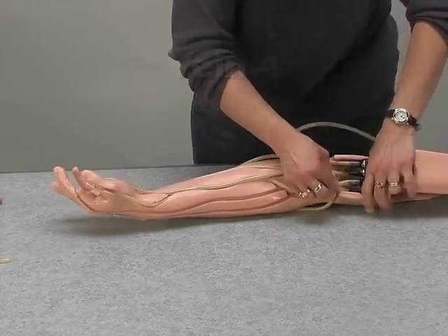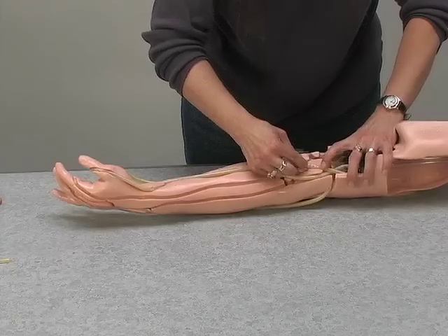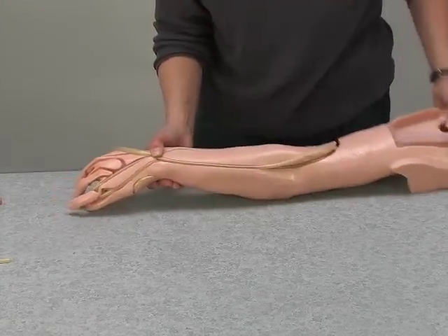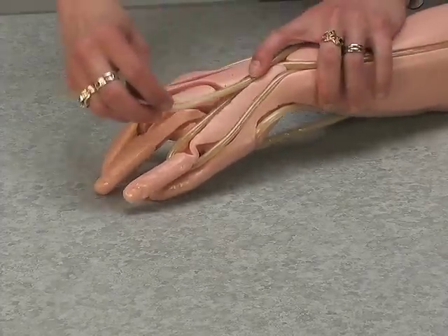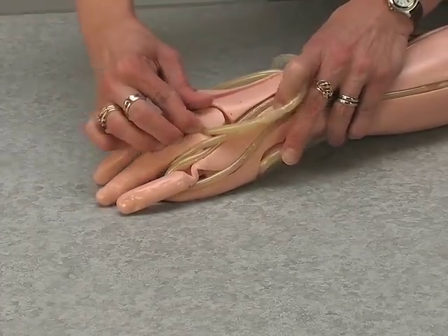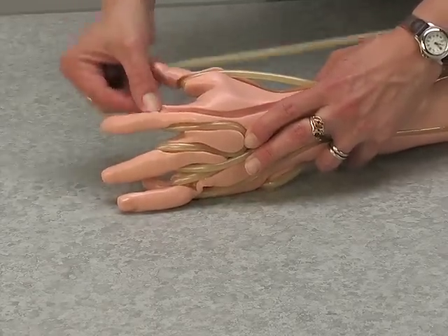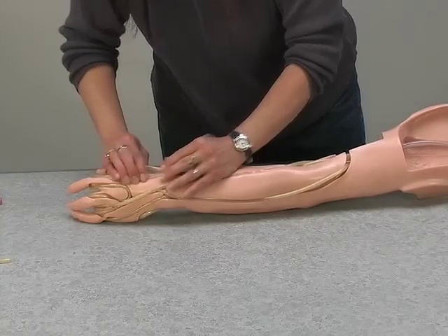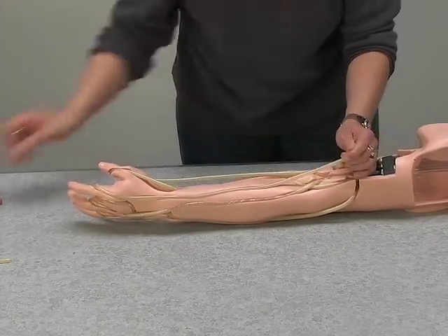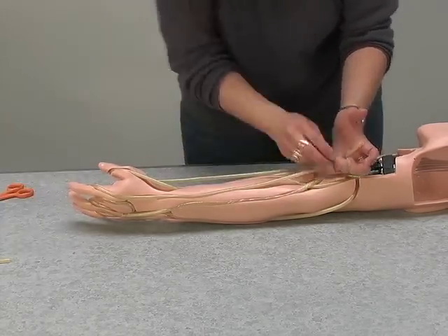Take the fourth and last vein, lubricate, and connect to fitting number six. Press it into the channel, taking extra care to minimize pinching in the loops around the two fingers and the back of the hand. Run the vein under the first tubing and over the length of the next set. Lubricate the end of the vein and connect to fitting number eight.